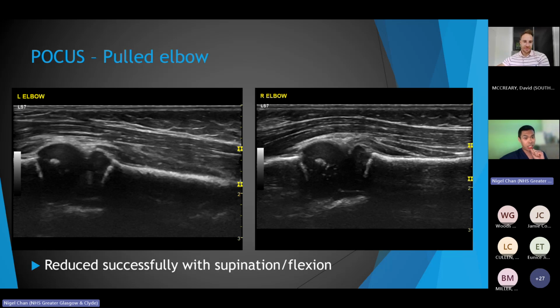And then the right arm was the one they were worried about, so I scanned his left one first. To be fair, it does look maybe a bit blunted and a bit tapered, but if you scan the one that was affected, you can see the difference, hopefully: this muscle here is completely stretched and pulled in.